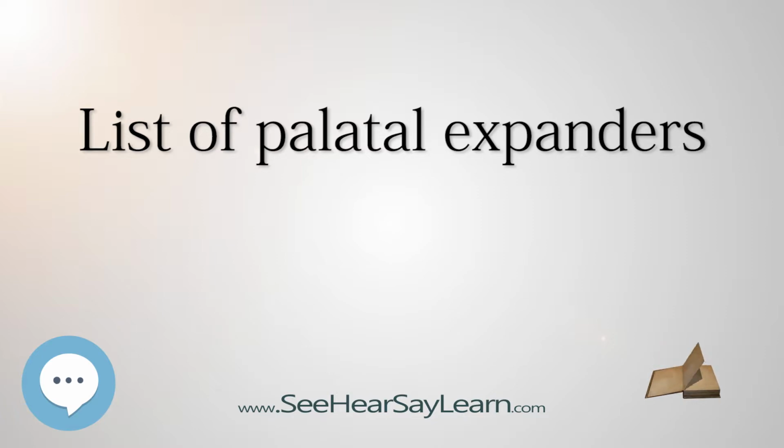One of the concerns of this appliance is that due to the forces being applied only to the teeth, there may be more dental tipping than skeletal expansion.